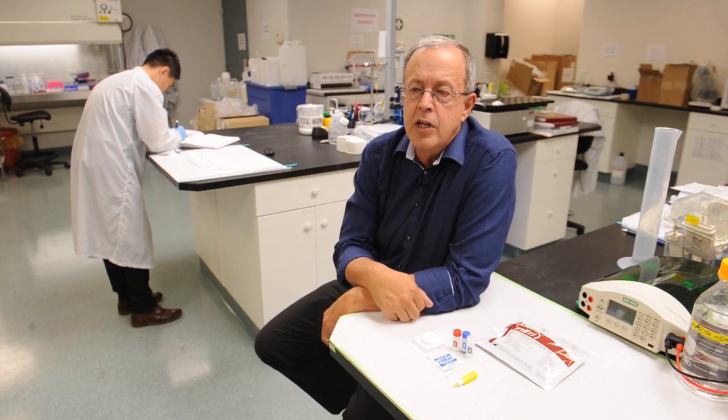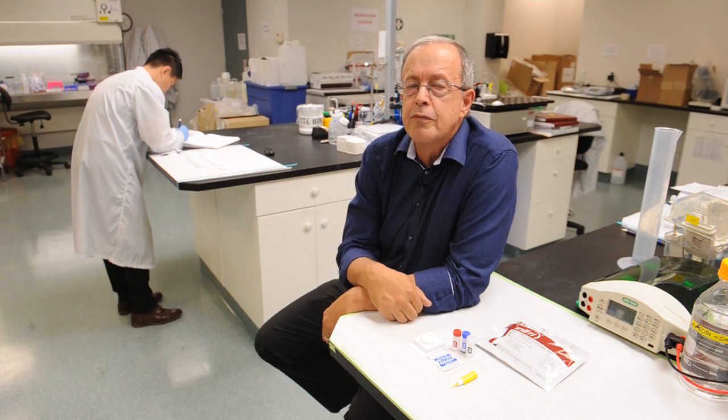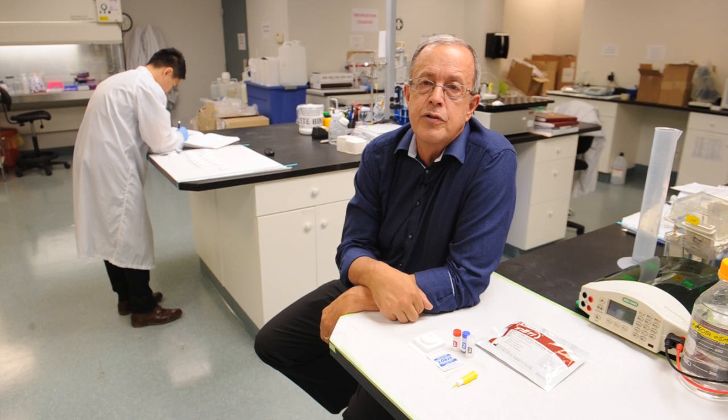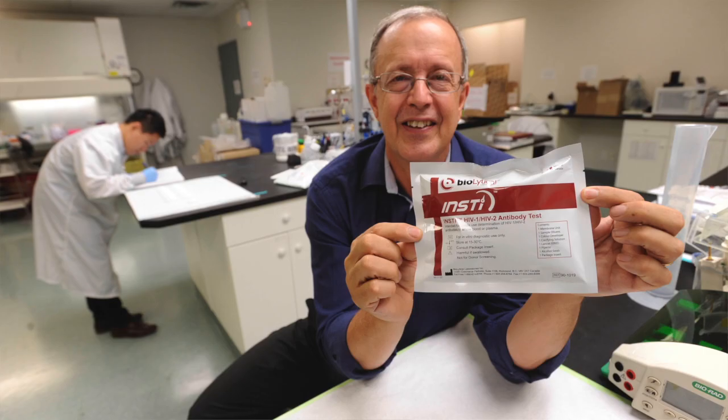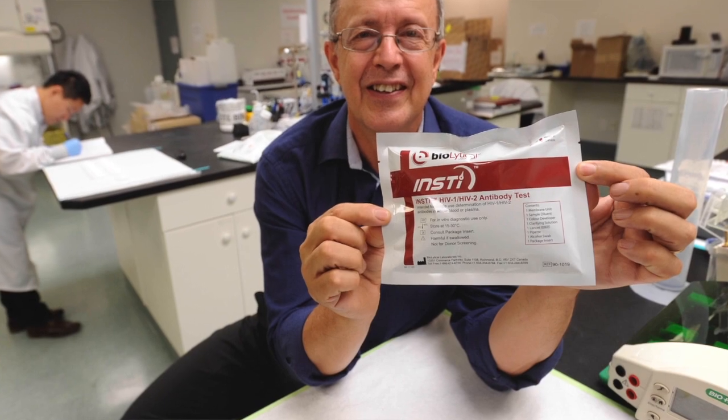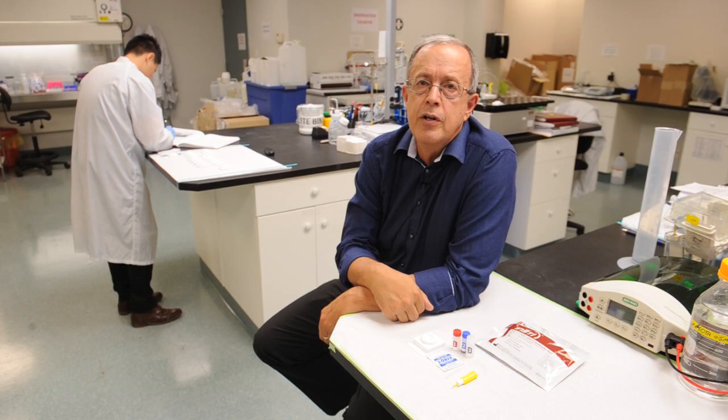It also makes the testing process very simple for test providers who often have to face large numbers of people coming forward for testing at one time. Our test is currently in use in about 59 countries worldwide, including North America, Europe, and Sub-Saharan Africa in particular.